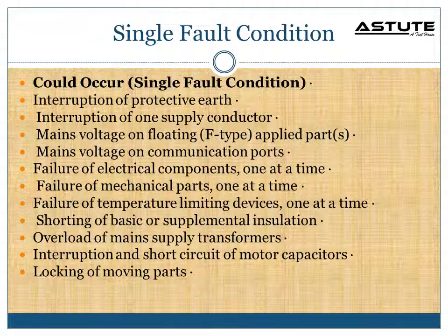Other single fault conditions are: signal input or output terminals, that is, communication ports such as USB or RS-232, mains voltage on floating, that is, F-type applied parts, failure of electrical components, failure of mechanical parts, failure of temperature limiting devices, shorting of basic or supplemental insulation, overload of mains supply transformers. Single fault conditions occur one at a time.